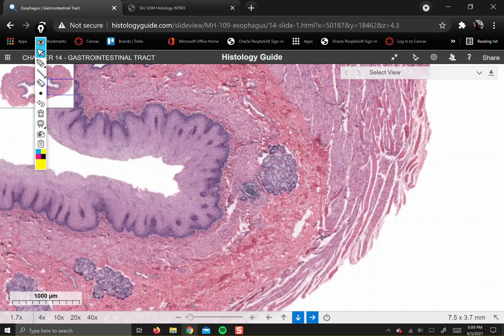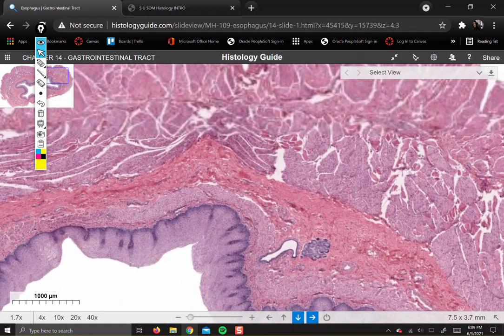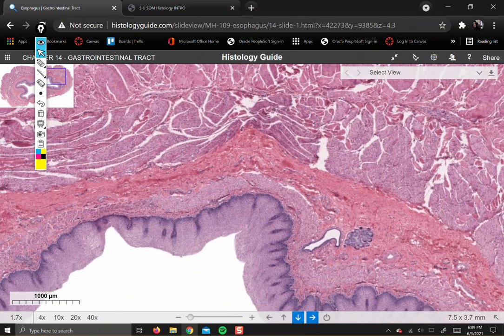Alright, let's see what else there is to see, if anything, but if I don't find anything that strikes my fancy, I think we're about done here.